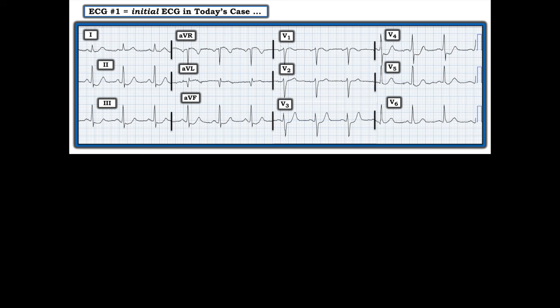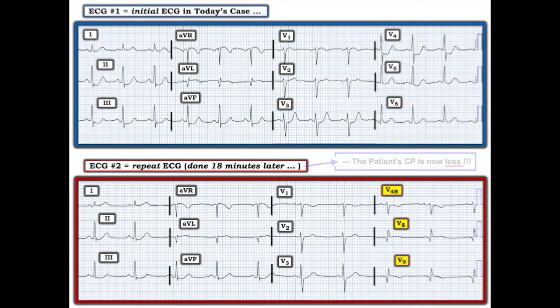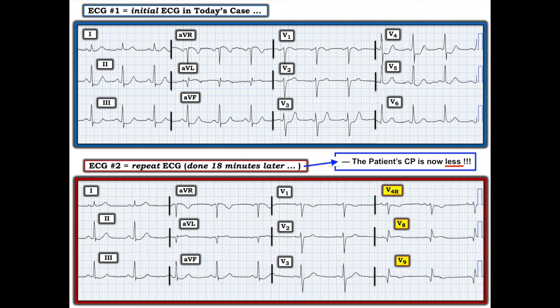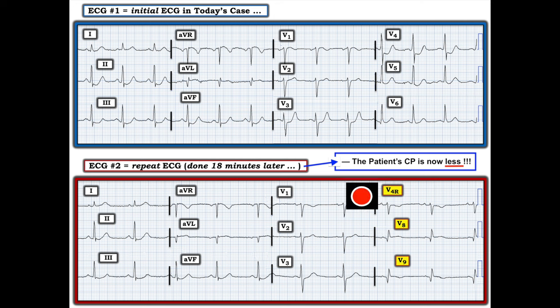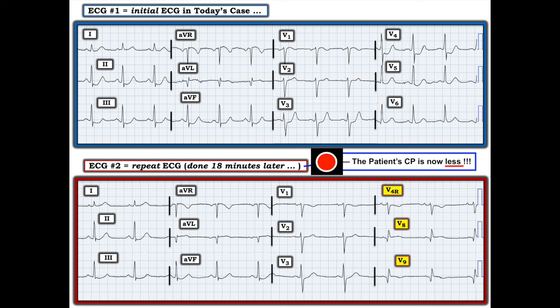A follow-up tracing was done 18 minutes later. The team recorded 9 regular leads plus V4R, V8, and V9 — replacing V4, V5, V6 with right-sided and posterior leads. My message: if you are going to do extra leads, do a complete repeat 12-lead and add the other leads, because here we lose what was happening in V4, V5, and V6. The patient's chest pain is now less. Before looking at the extra leads, compare the two ECGs.